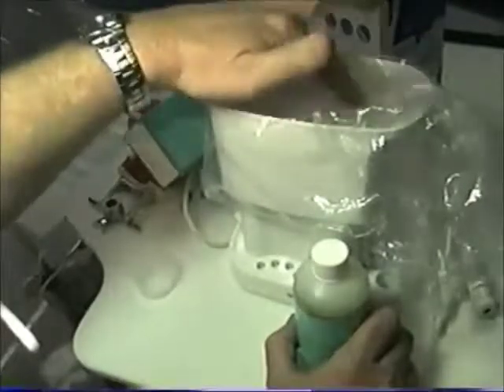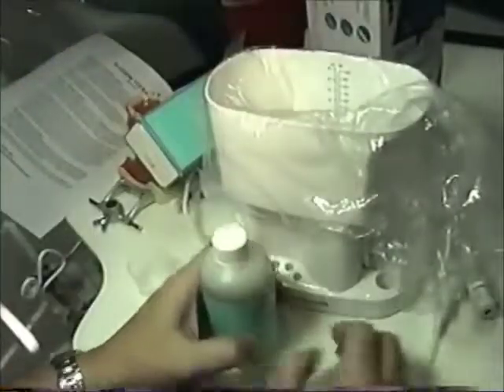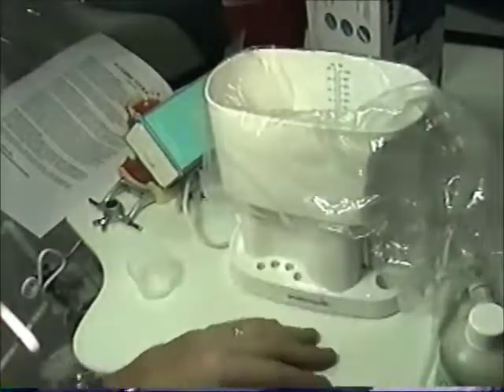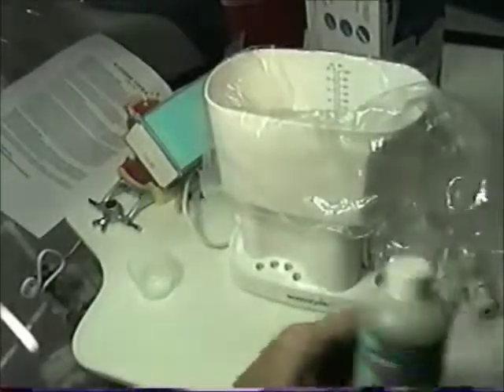So after you fill this up with water up to the full line here, and you squirt 2 squirts, you take your finger and stir it up real good, and then you just use this. It has a good taste. Do not use more than 2 squirts of this.